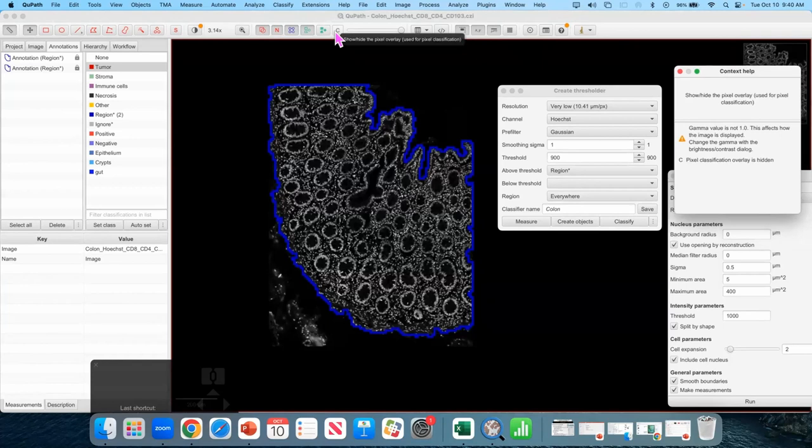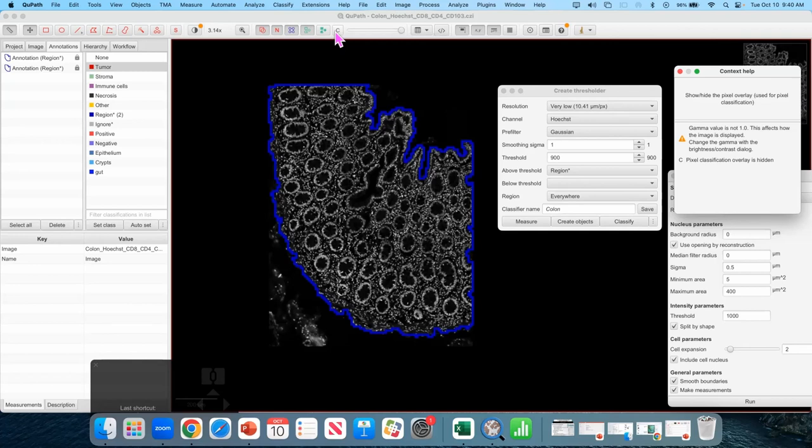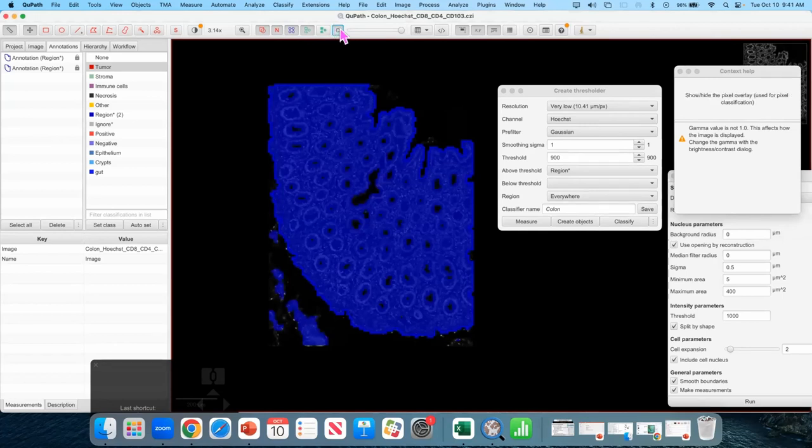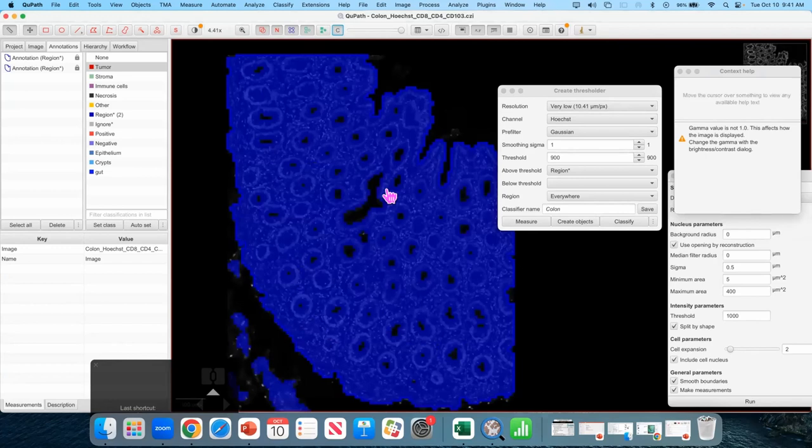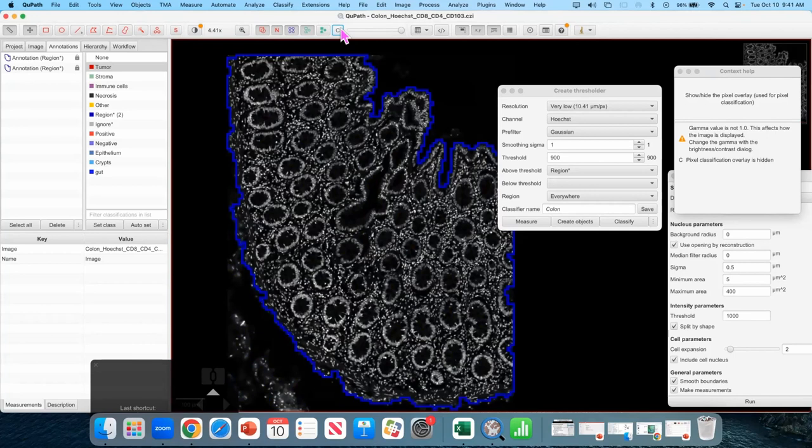So removing all those holes when they aren't biologically important to your question you can make the QuPath run smoother. Yes so what Mike was saying is that the QuPath runs faster if your annotations are relatively simple. If you have a huge annotation and you subtracted every tiny little lumen and there's all these little intricate details it slows down all of the further processing. Is there a toggle because the whole blue or the whole blue is going to be outlined? No it the it's going to be the same color. What you might have on is this. This is the threshold classifier. It's showing you exactly which pixels are classified.